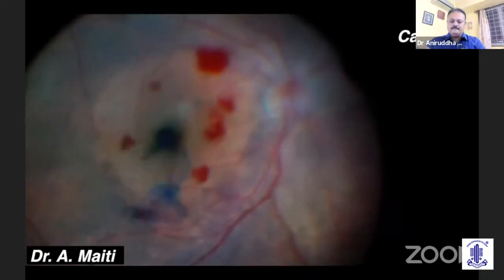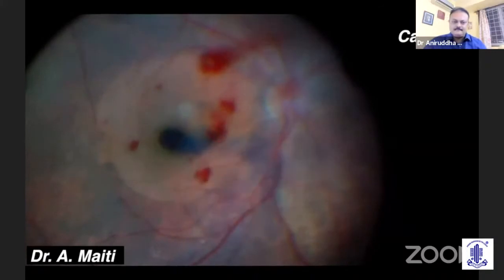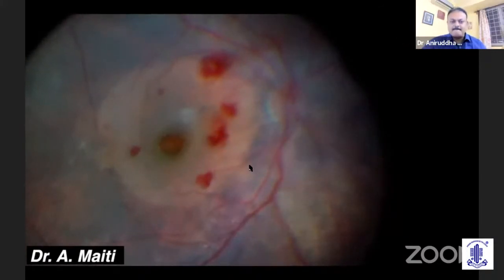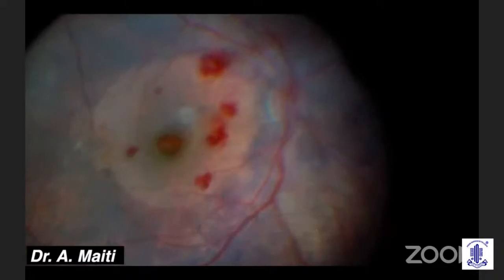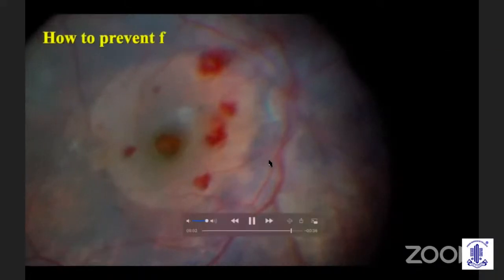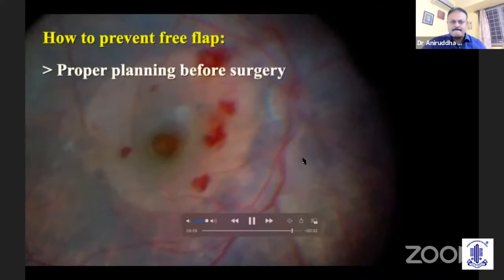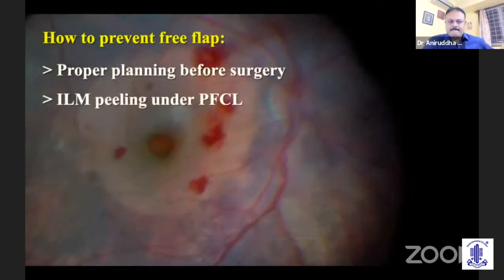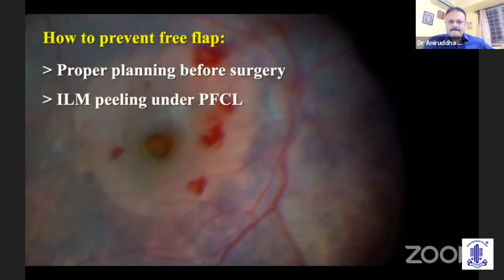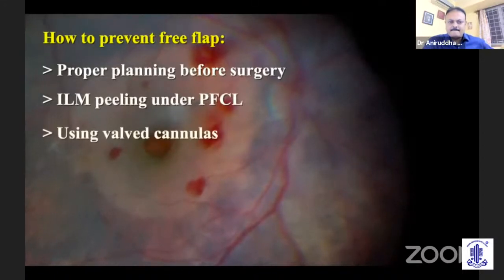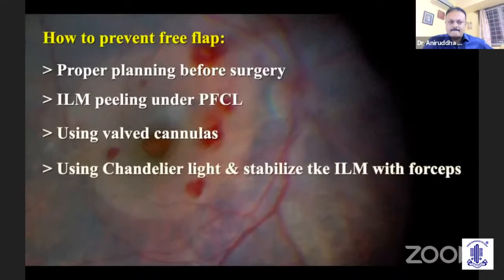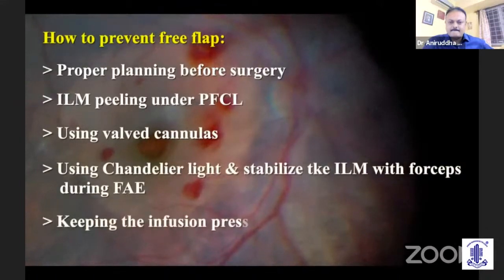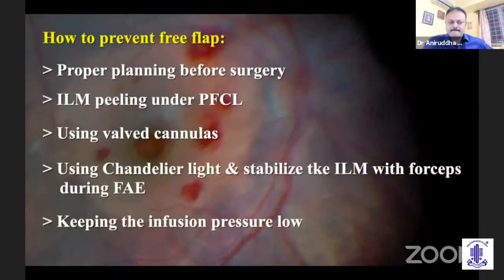But as I shifted to fluid-air exchange, the flap dislodged from the macular fold. Ultimately, the hole was closed nicely by conventional peeling and mechanical manipulation. The take-home message from the video is to have proper planning before surgery. Steps like putting PFCL while peeling the ILM, using a valved cannula, or using a chandelier light — with which we can stabilize the ILM with a forceps — could have prevented the lost flap.